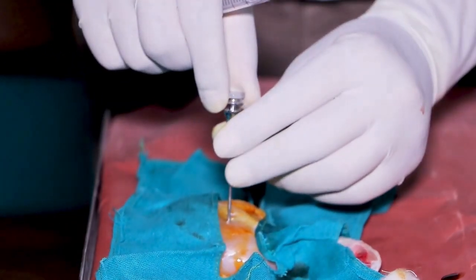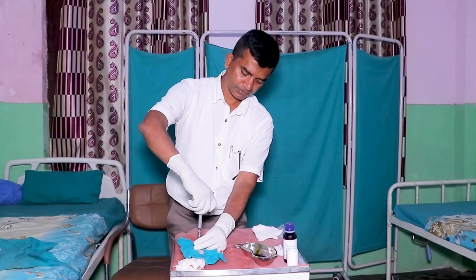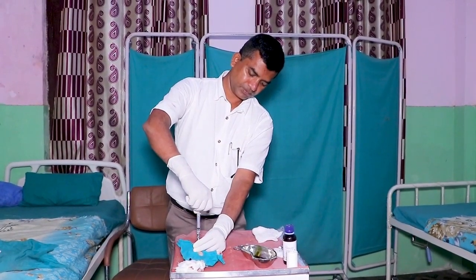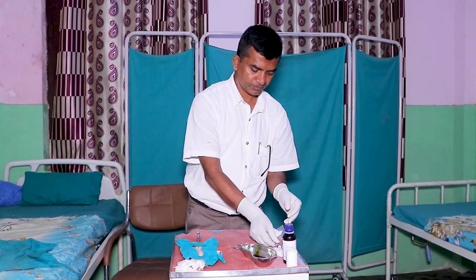Remove the stylet and attach a 10 ml syringe. Attempt to aspirate bone marrow. Use only to check the blood sugar.